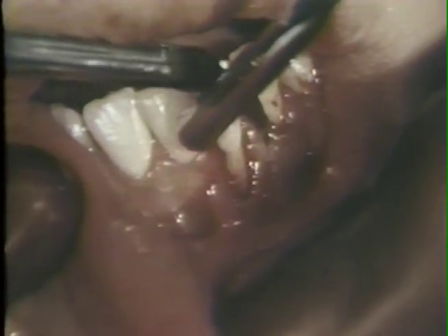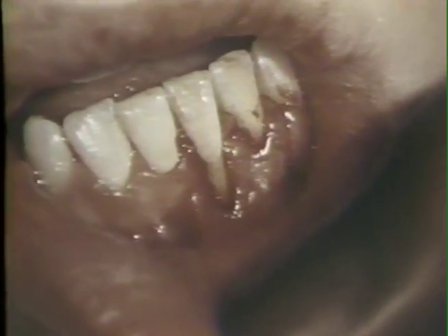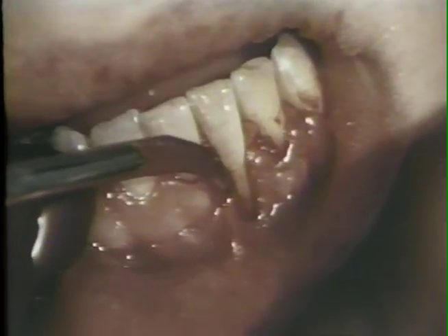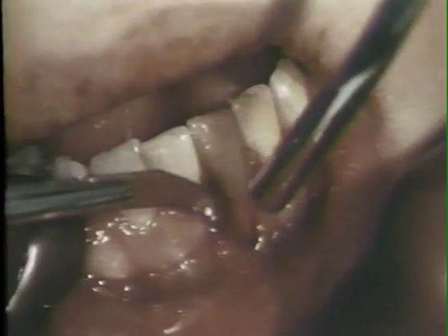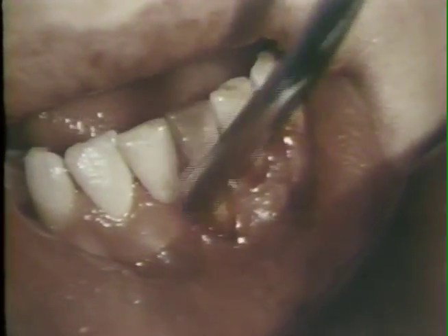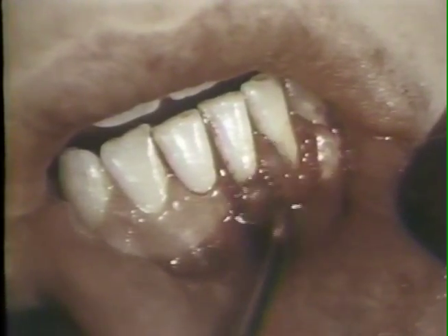The flap is immediately placed back to its original position and the mesial aspect of the cleft is inspected. The frenum attachment is excised with a barred Parker number 12B blade to avoid future frenum pull on the free gingiva. The flap is gently pulled laterally to cover the cleft. It adapts well to the surrounding tissues and can now be sutured in the new position.